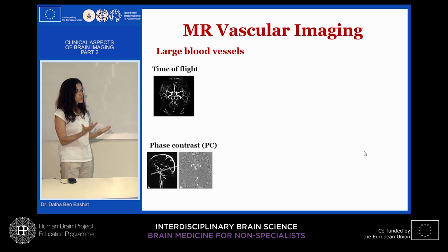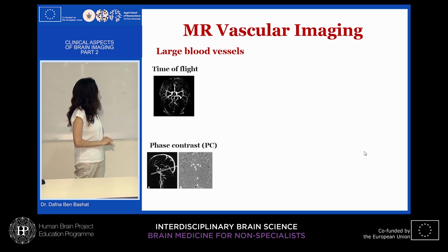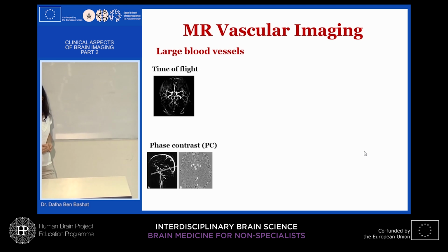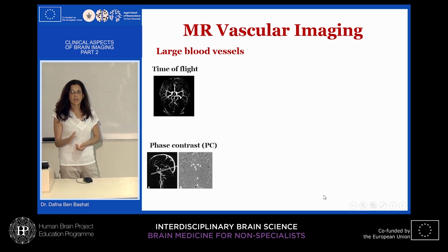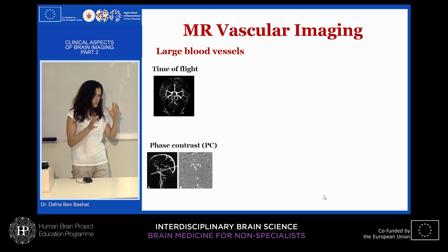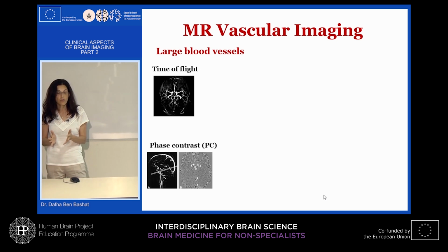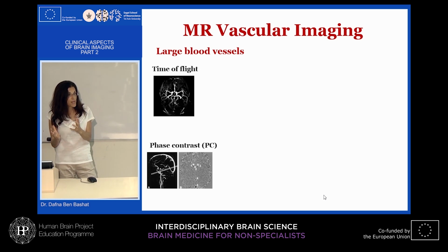So in many disorders, like in any disorders, we can correlate or relate also to abnormality in the vascular system. So we have many methods, and I said MRI is multiparametric. There are a lot of methods and different aims. If we want to look at brain function, we look at the fMRI methods. If we want to talk about structural connectivity, we'll go to the diffusion-based methods.